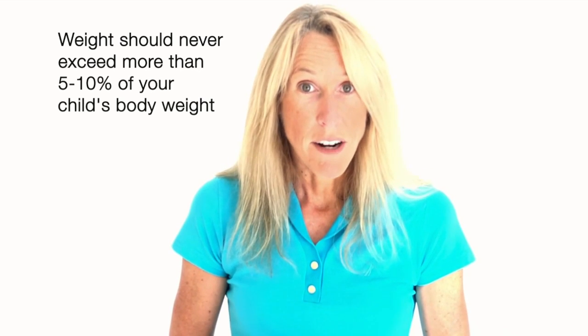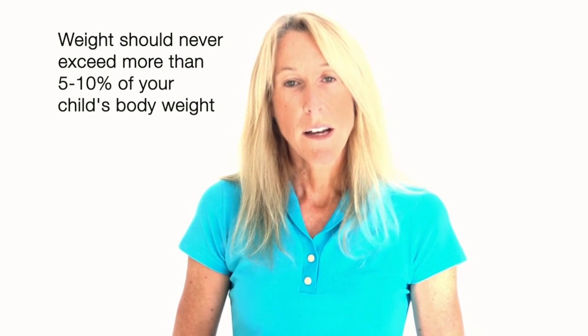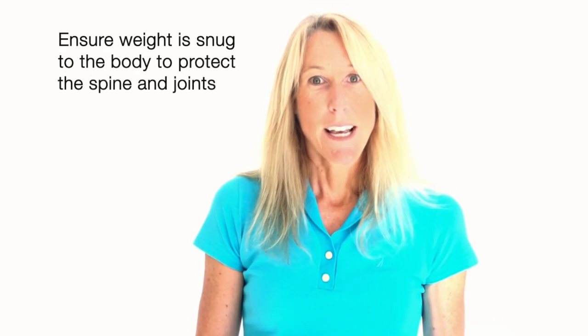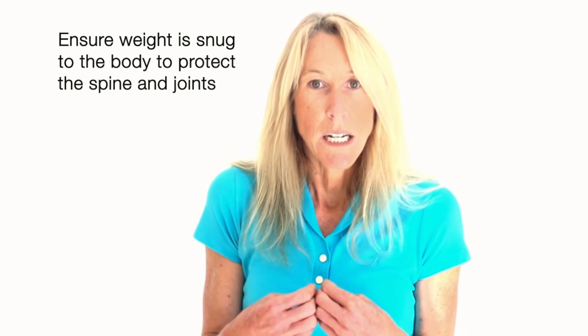Weight should never exceed more than 10% of your child's body weight. So get your child's body weight and then make sure the device you're using does not go over 10% of their body weight. Usually it's a range between 5 to 10% of the body weight. So just make sure you're within those guidelines. And then the last thing is make sure that the weight is always close and snug to the body.